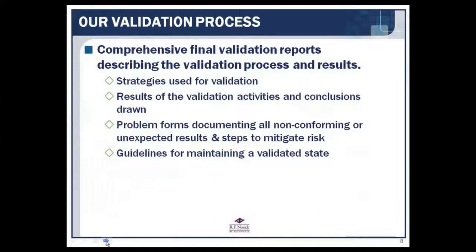Once we're done with validation, the validation is actually run through the Sanctuary Validation program. All the results are tabulated. They're passed. They're failed. Our analysts go through and we review everything.